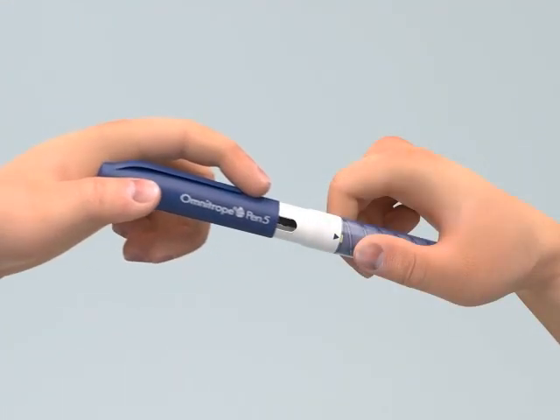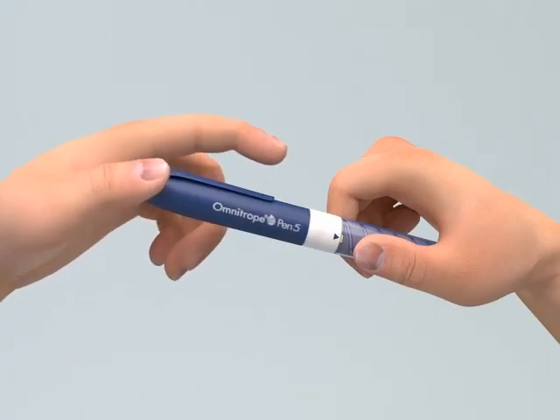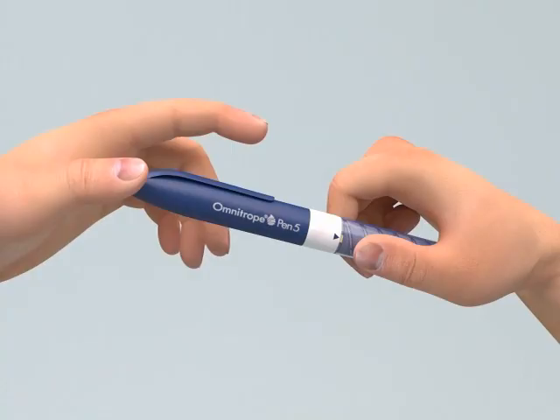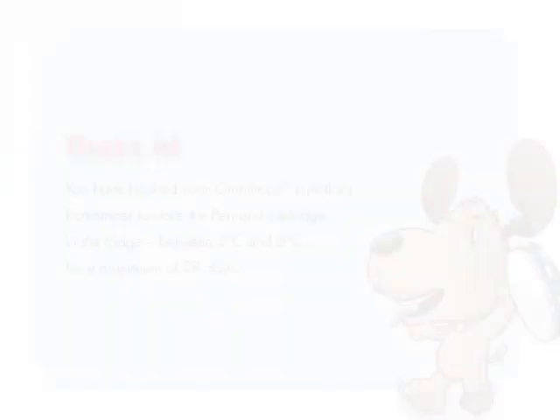Recap the pen. Your Omnitrope pen can now be stored in its pouch to protect it from light. Because the pen now contains an Omnitrope cartridge, it needs to be stored in a refrigerator between 2 and 8 degrees Celsius.